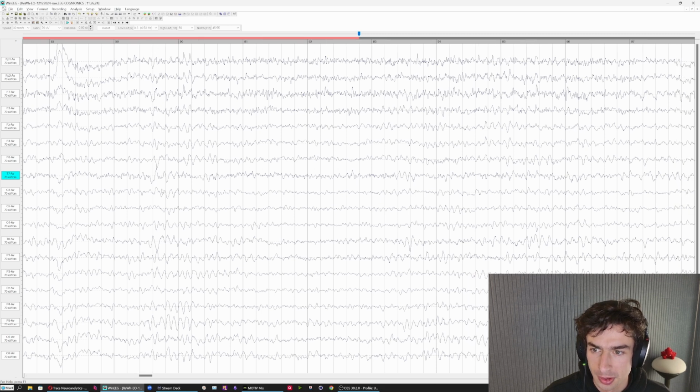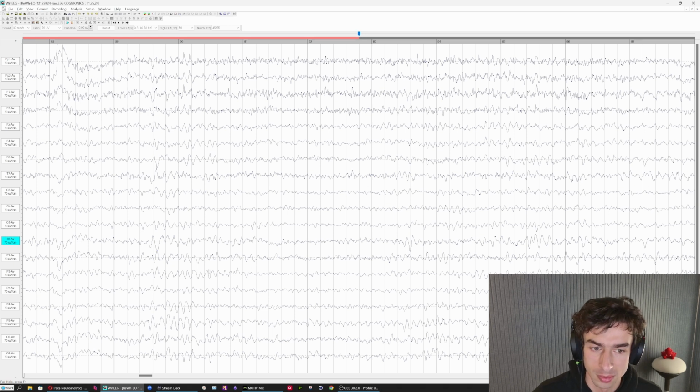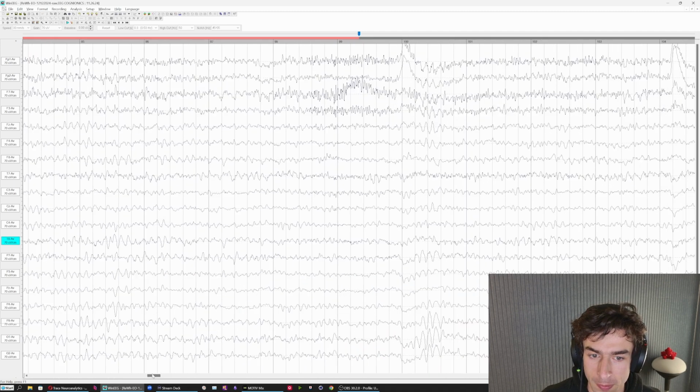Interesting feature here, where there's this sort of spiky appearance to the alpha band activity. Looks like it is phase inverted from left to right. So if I drag T8 up to T7, we can see this is sort of an alpha generator that is in the thalamus and projecting from left to right.